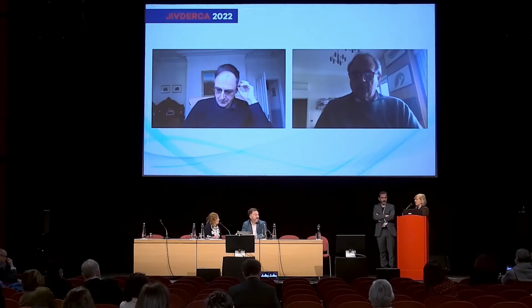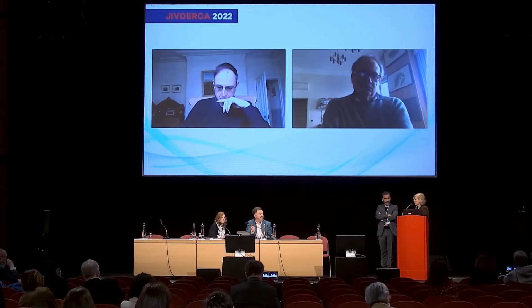Okay, we have a question from Spain, from Navarra, from Cristina Siorba. When you mean high flow therapy, which is the level of flow you are using? Because I suppose, according to the definition of high flow oxygen therapy, it is when it's above the peak inspiratory flow of the patient. How do you set it? I usually, in the chronic patient, use around 30 on average. That may be also 35 if we have good tolerance and an improvement of symptoms, yes.